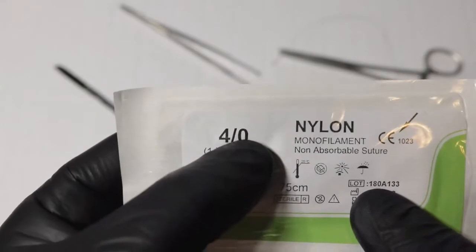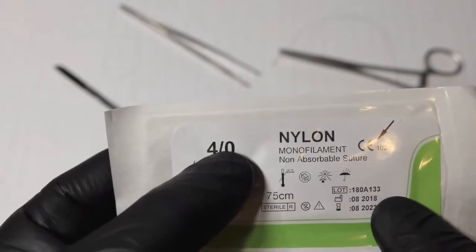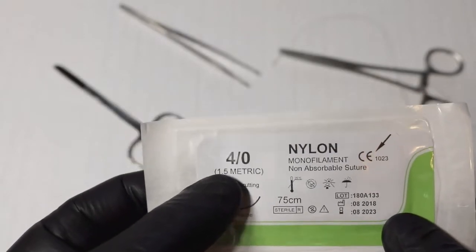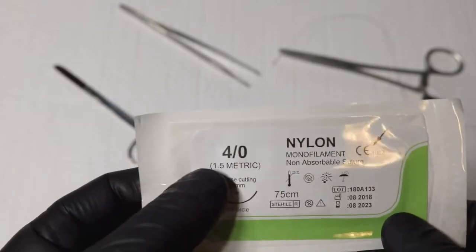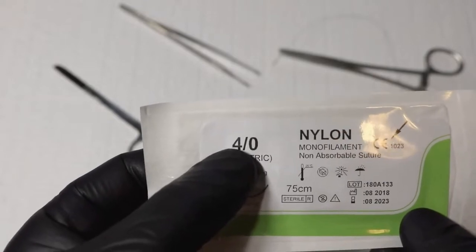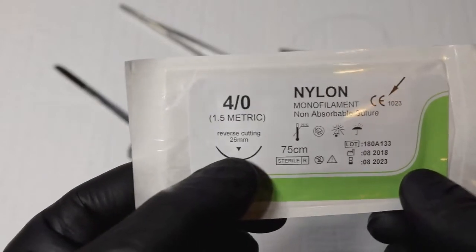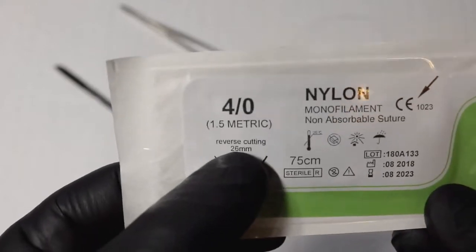So here we have a 4-0. A 6-0 or 7-0 would be something very fine, used on the face. Typically in most of your laceration repairs you're going to be using anywhere from a 3-0 to a 6-0. A 1-0 is pretty thick, 2-0 is thick but less so, and as we go higher the thread gets finer.